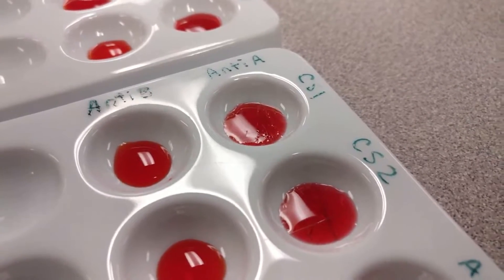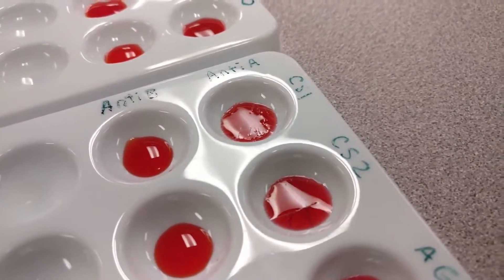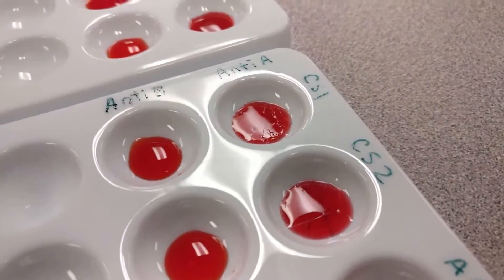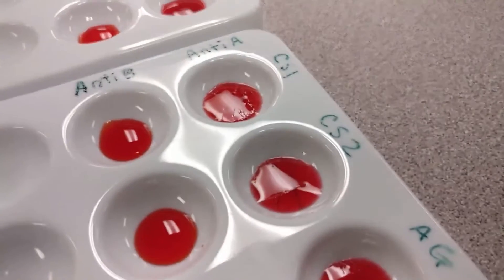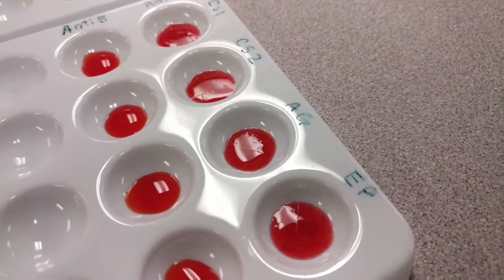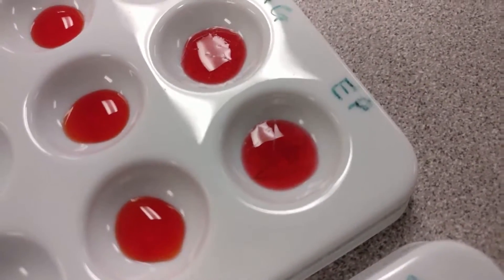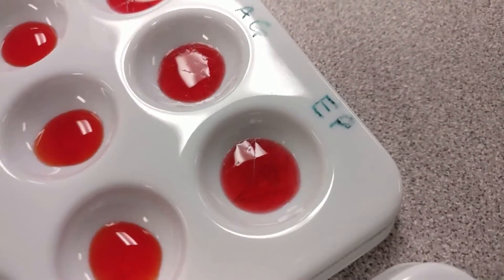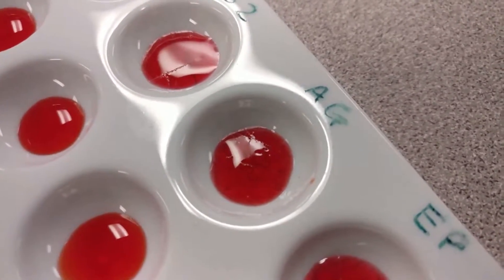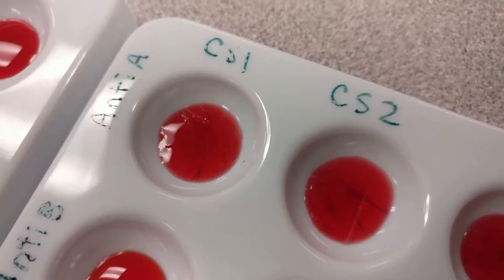Now let's take a look at the crime scene samples. It's a little bit more difficult to see — it's not as easy to see the clumping. However, you can see that there is substance built up within these wells. Here is Ana Garcia and her boyfriend Eric Piedmont, and here are the crime scene samples.